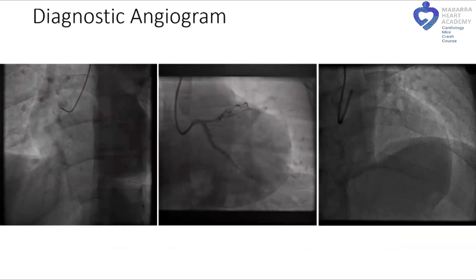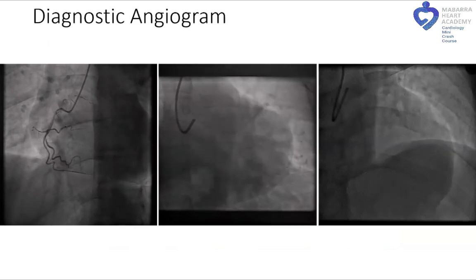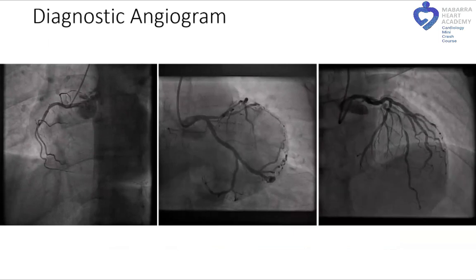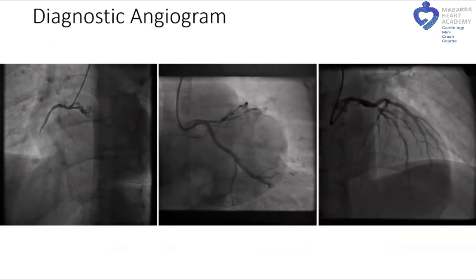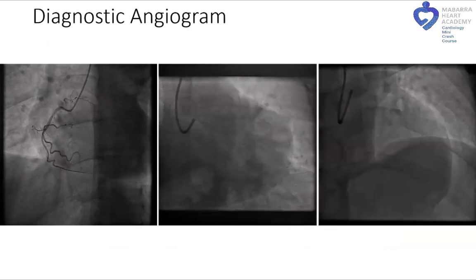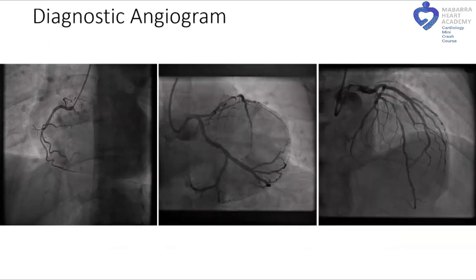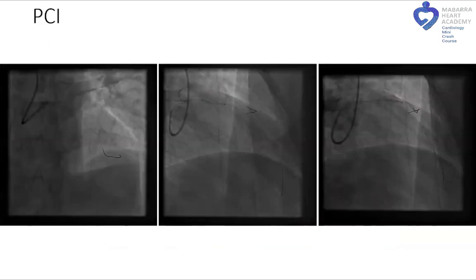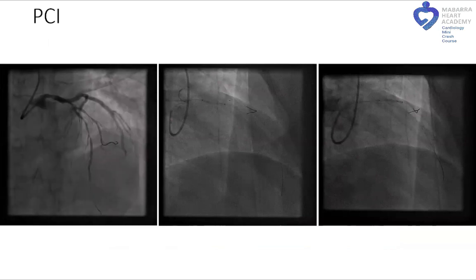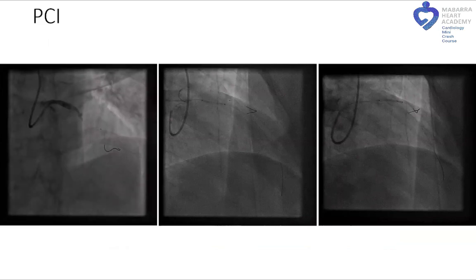The left main was fine. The left circumflex had only mild irregularities. And he had a long segment of disease from the proximal to mid-LAD and diagonal vessels. So we decided to proceed with PCI. So in this example, I wired both LAD and diagonal.